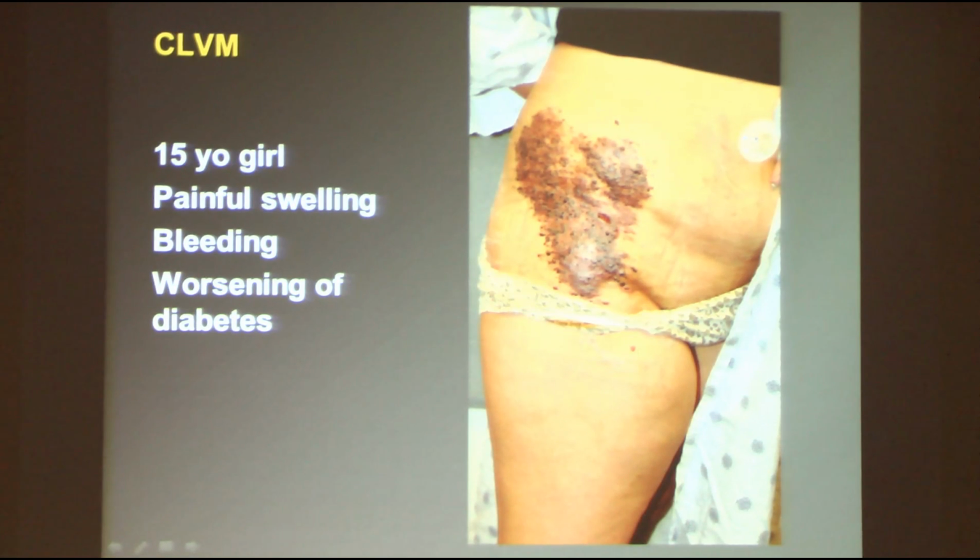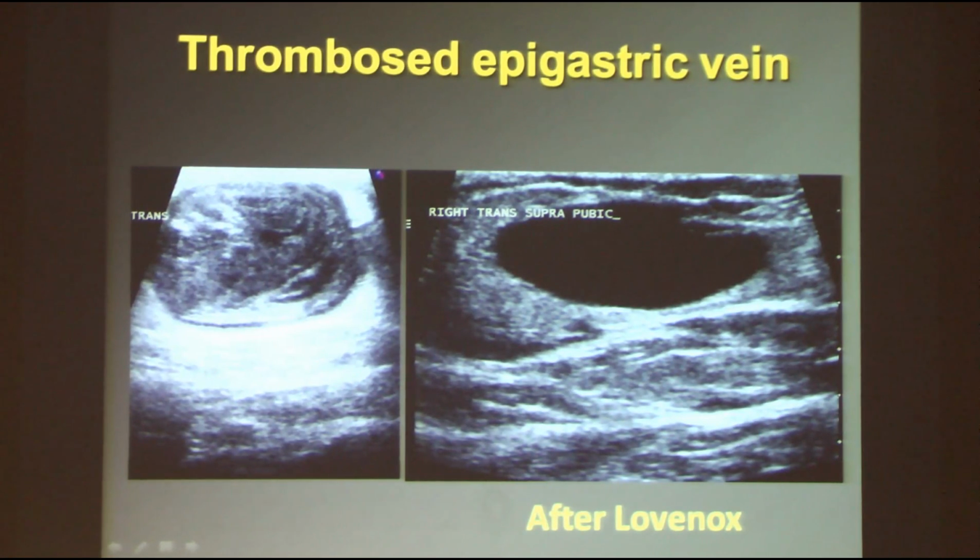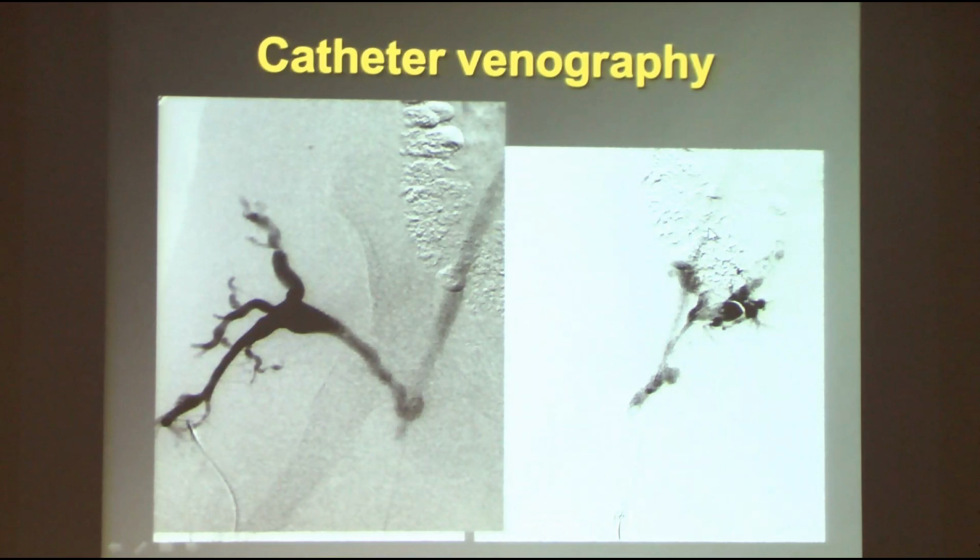This patient has a capillary lymphatic lesion only in the hip area, but she has symptoms related to thrombosis of these abnormal veins. And so these are quite amenable to closing them. You can see this big clot that formed on this ultrasound study in one of those veins, responded to Lovenox, but kept coming back. And this is what they look like with contrast in them.